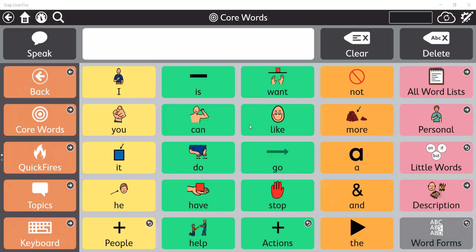Hi, this is Anya Slindy, Solutions Consultant for Tobii Dynavox, and today I wanted to talk about eye gaze options within Snapcore First.